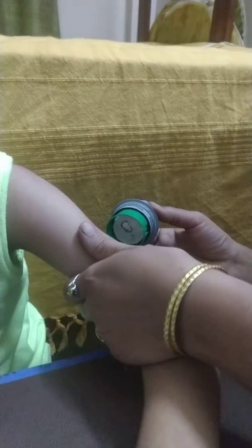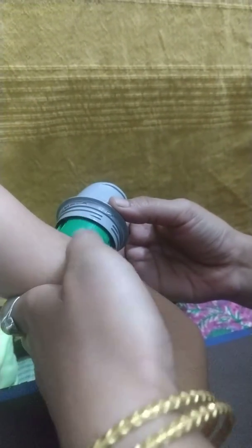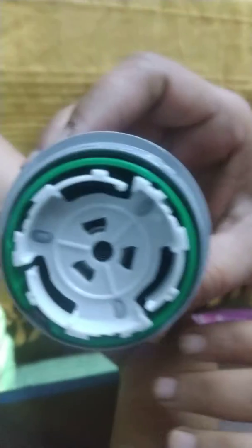Can you see the needle? Six step. Now the seven step, be careful. Just press it. Turn it. Turn it and remove it. Eight step. Now the nine step, gently — we should do it very fast. Thank you. Bye bye.